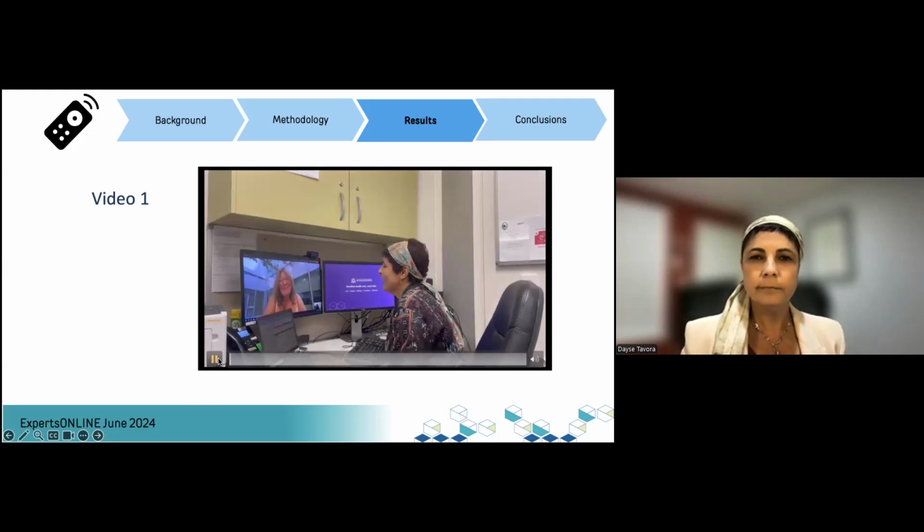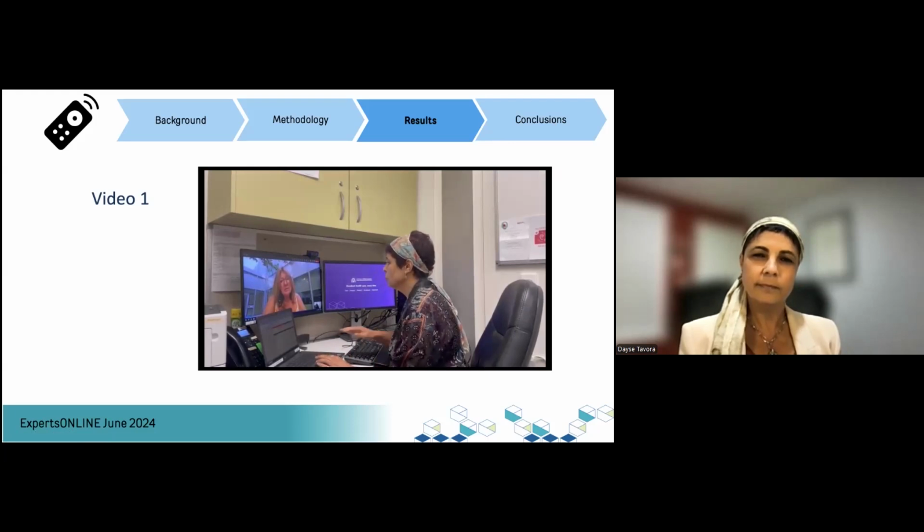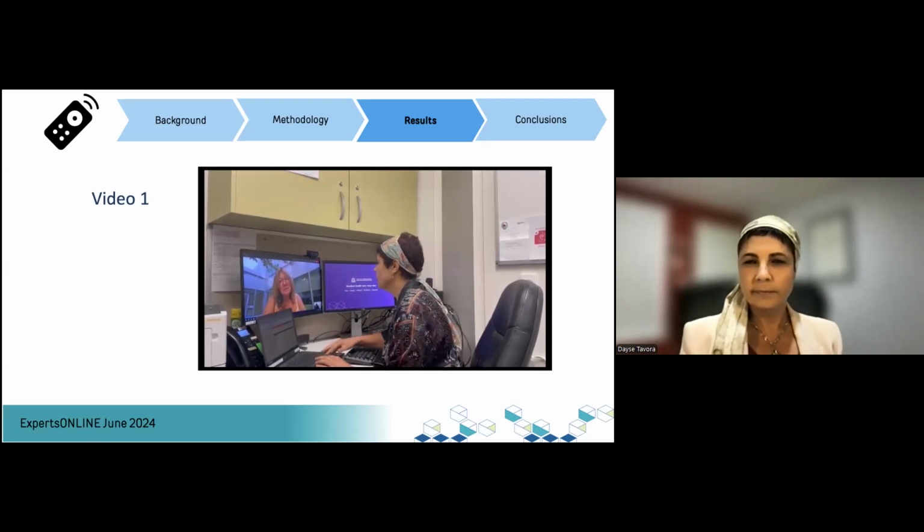Good. Sally, what we are going to do is just to practice how the remote care is going to work for you from home, okay? Yes. So you have your app on your phone. What I need you to do for us to start the remote care is to check the system for you.